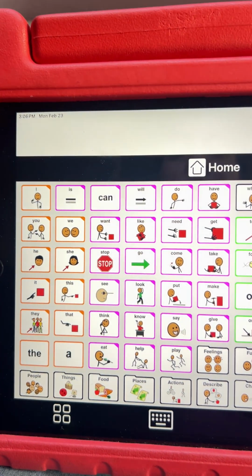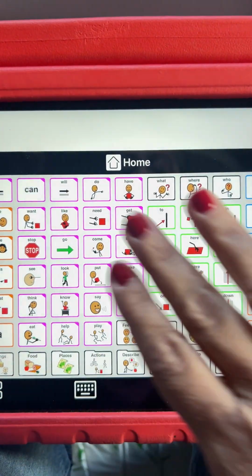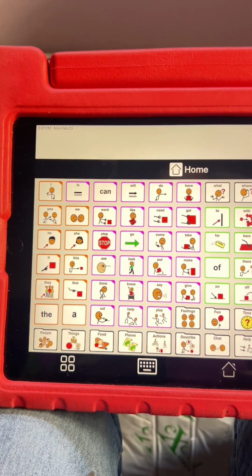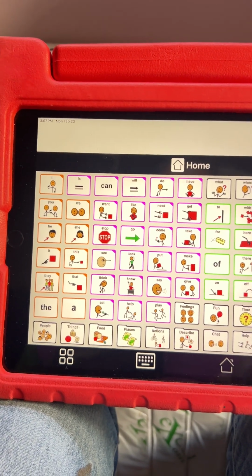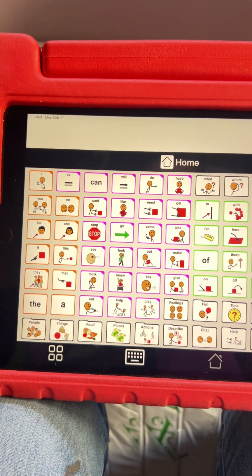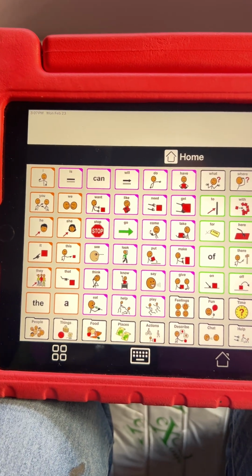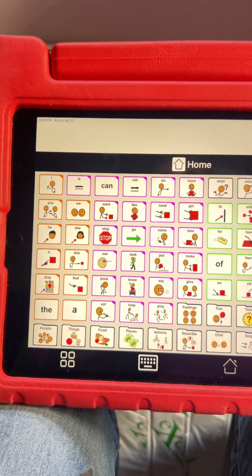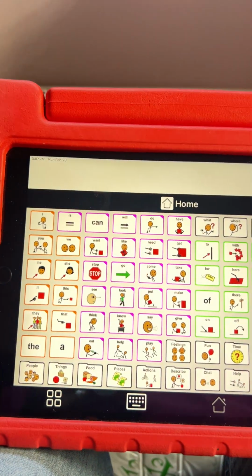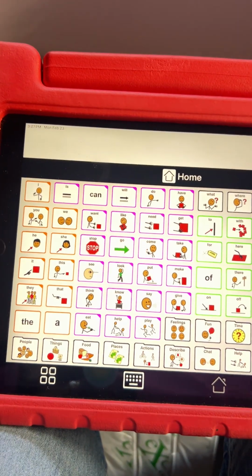So once you start getting used to it, it just becomes muscle memory. You start to know where all the keys are. There are different programs and different AACs, but in general, you can give yourself a muscle memory about where they are, maybe what file to find them in. You can always talk to your speech pathologist or the person in charge of the AAC device so that you can put a specific word in a specific file, easier for you to find, as well as your client.